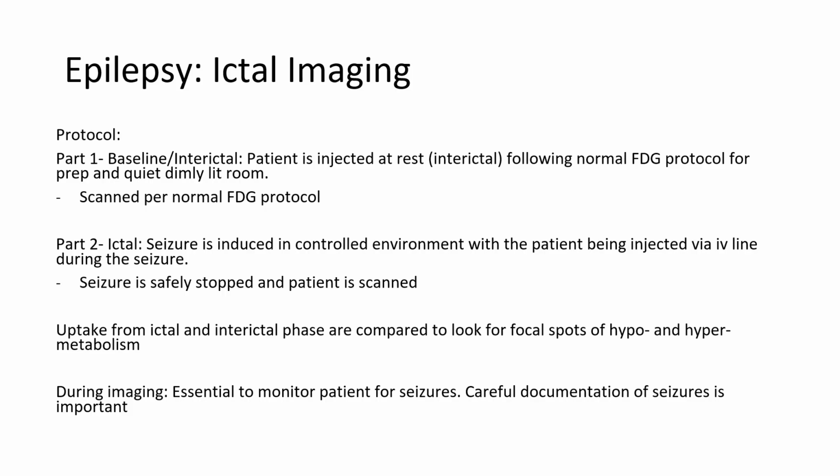If you're doing PET like this, their head is inside the machine and they're on a thin table too. So you don't want the patient to hurt themselves. You don't want them to jerk up. I mean, they can't help it, but sometimes they sit up. If they sit up, they're going to hit their head on the scanner. That can really hurt them. And so it is important to make sure that you are watching them at all times.